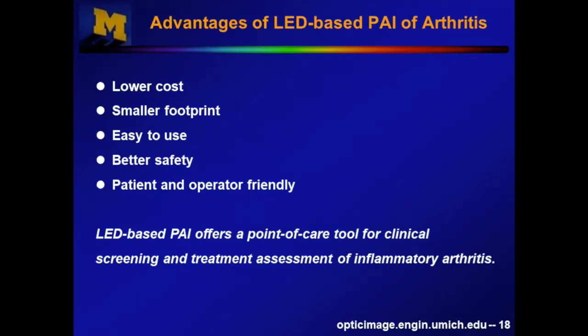Our patients involved in the study don't have any concerns about putting an LED light source on their fingers to do the imaging. So really, LED-based photoacoustic imaging offers a point-of-care tool for clinical screening and treatment assessment of inflammatory arthritis.